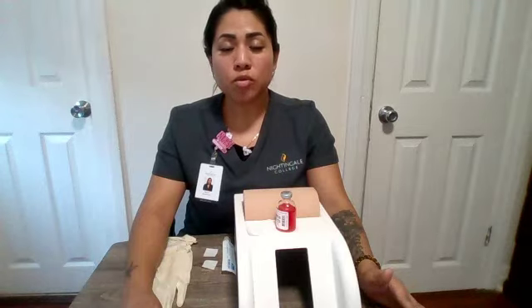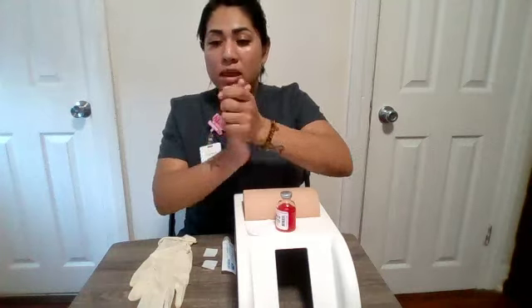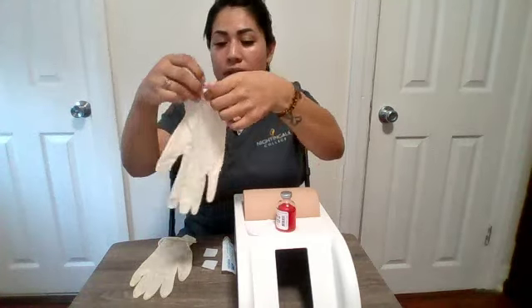Also, just so you know, you may feel slight burning or a stinging sensation while I'm administering the injection. Do you have any questions for me? Okay, we're going to go ahead and move on. We're going to perform hand hygiene, and I will apply clean gloves.